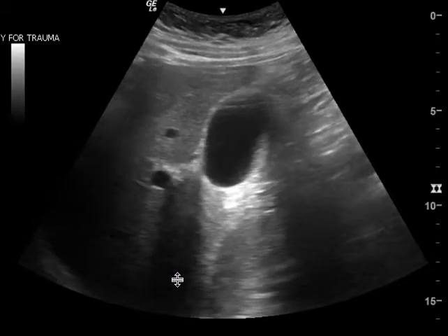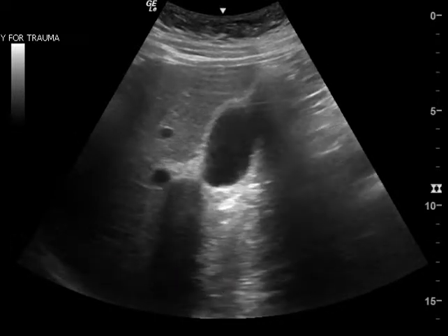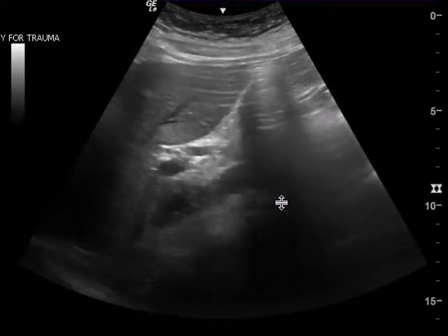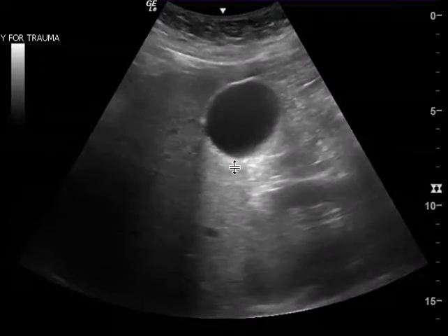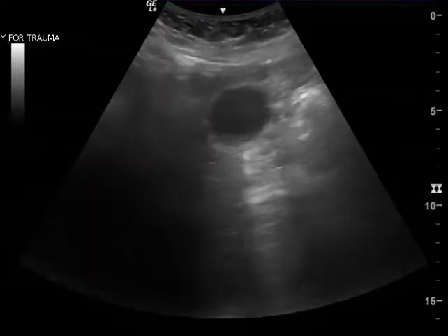Now it truly is difficult to tell, so my suggestion is that in addition to this clip — which gives you a great view of the gallbladder fundus or body — you should also show me the neck of the gallbladder, which would be super helpful.